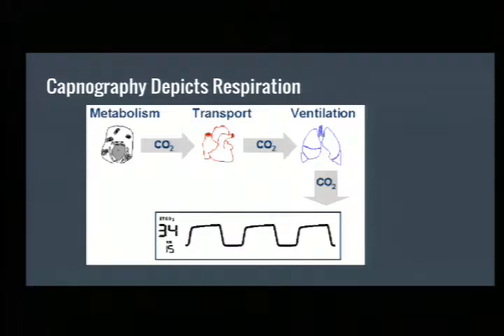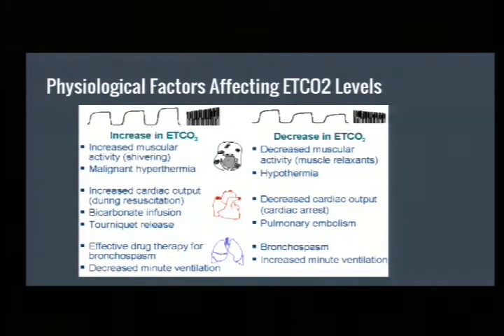So that's the waveform you're looking at, and this is just another pictorial of that CO2 moving, why it shows up on your monitor, and what it's looking at. So, physiologic factors that affect our end tidal level.